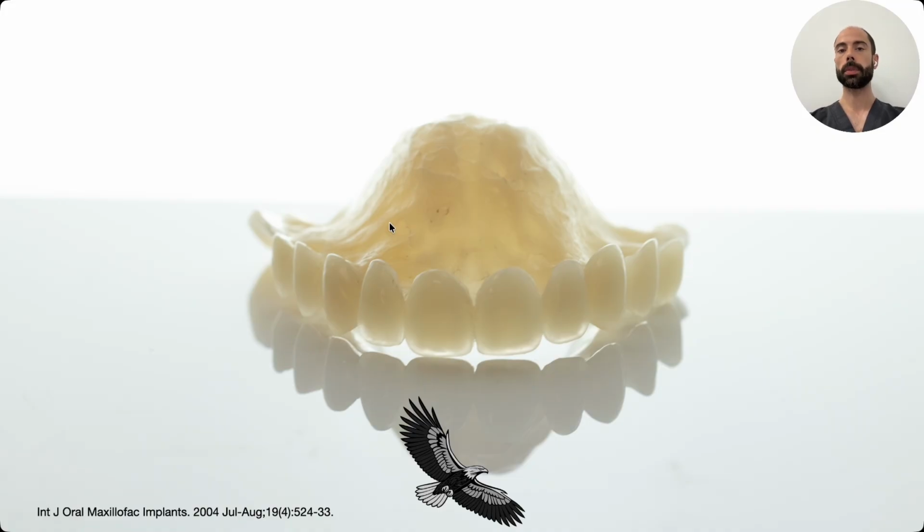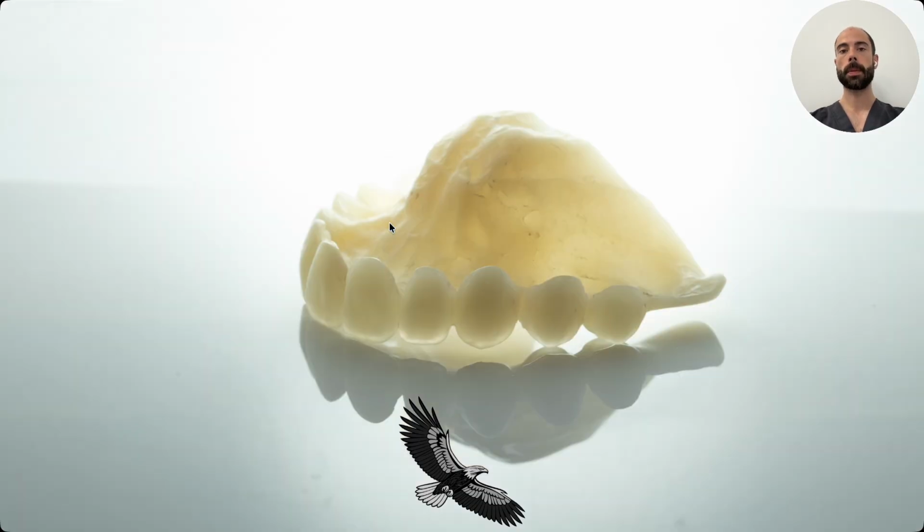Now let's talk about the provisional itself. We fabricate the provisional before surgery based on our digital planning, our DSP, or even our wax-up. The critical contour, the emergence at each tooth, the gingival zenith positions, they are already defined in the lab. But the subcritical zone, that's left open, and that's intentional.